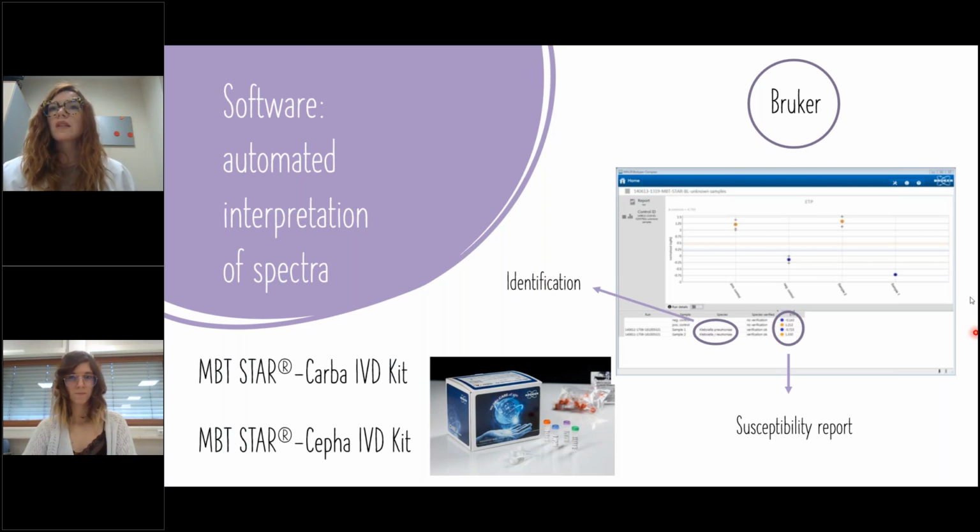So when you see just the conventional susceptibility testing and you observe this carbapenem resistance, you get more confident if you perform a MALDI assay because you measure the real activity of the enzyme. So for me, it is quite helpful to implement control measures at the hospital.